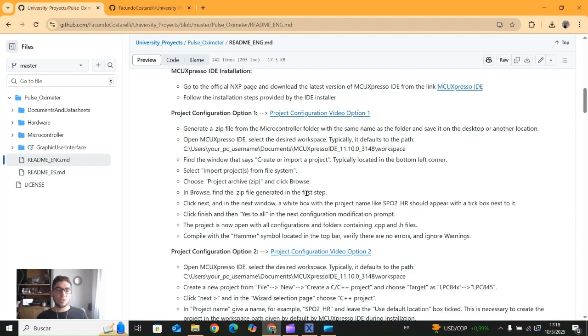With this way we are going to be able to set up a project to download any project from the internet, from GitHub or whatever place we want to extract or download any project, and we are going to be able to use it as it is, maintaining the same configurations that were made for that project. Not only the files, but also the configurations that may be related to compiling, debugging, or anything else. The MCUXpresso IDE configurations properly.